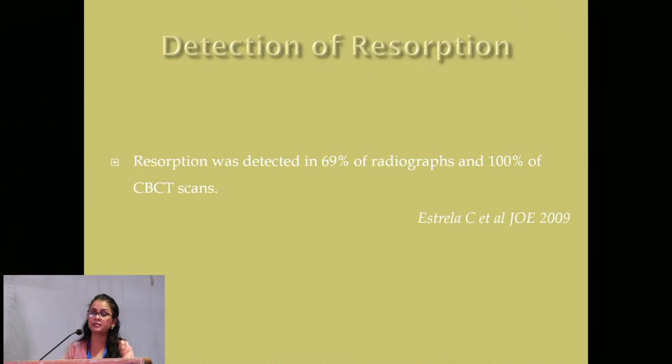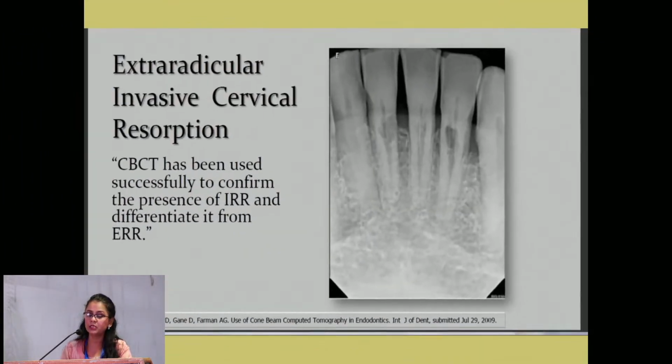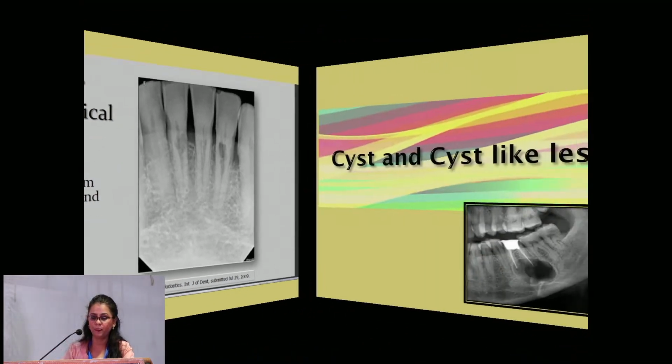Resorption was detected in 69% of radiographs and 100% of CBCT scans. So whether the resorption is internal or external, that can be best visualized and well differentiated only on CBCT.